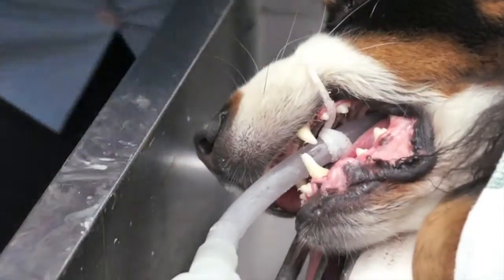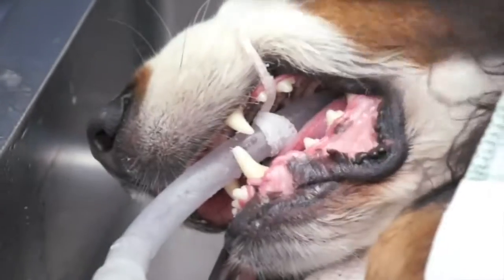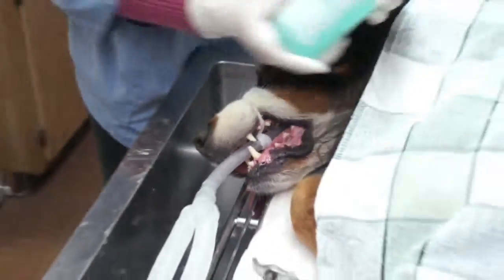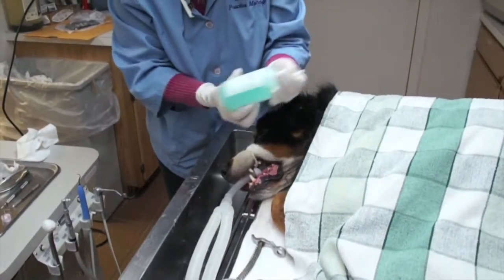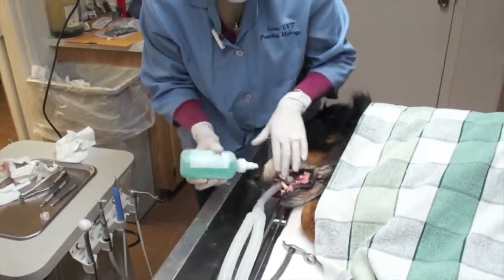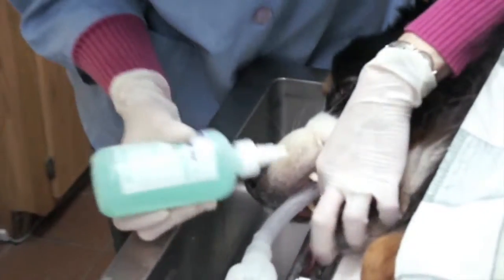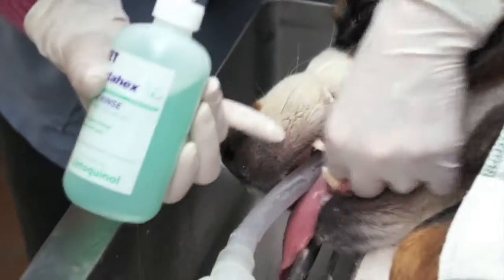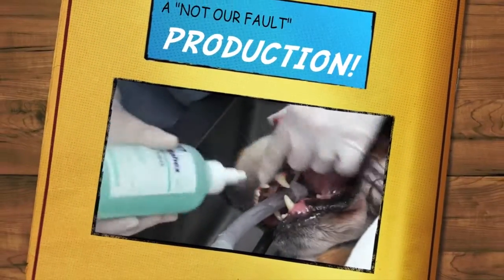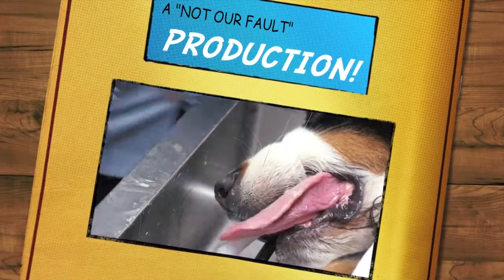My very final step on this is I'm going to end up rinsing the mouth. Normally we like this to dry, but I'm actually going to just take a rinse. It's a chlorhexidine rinse. It's going to give a really nice minty smell. The toothpaste itself was a berry flavor. I usually like to rinse off the tongue. And that's the first side of the dentistry.